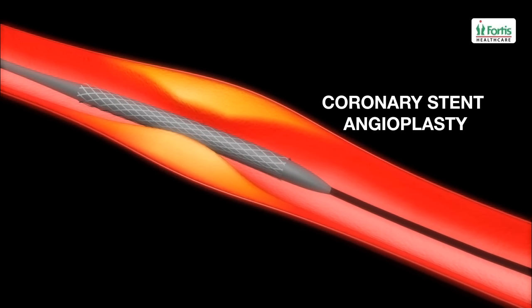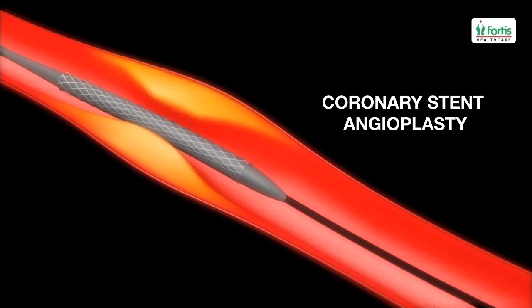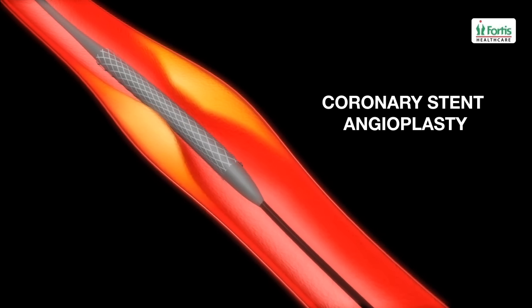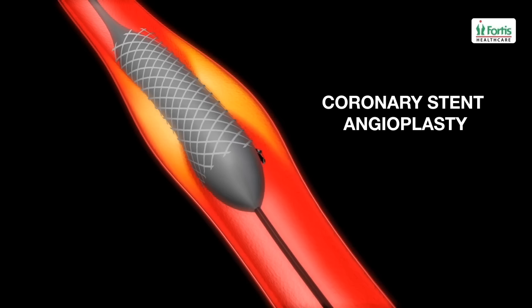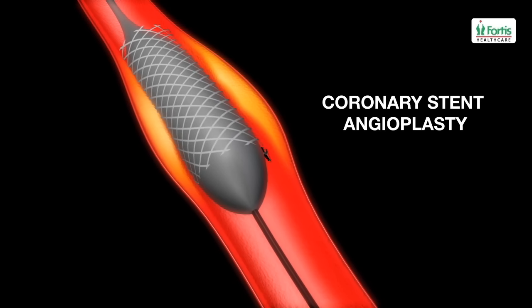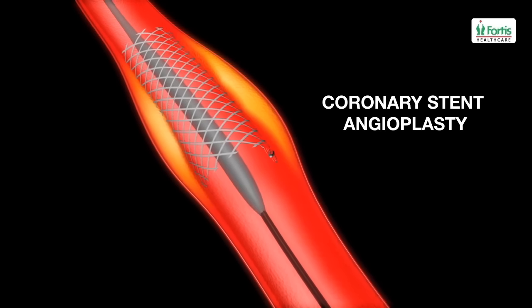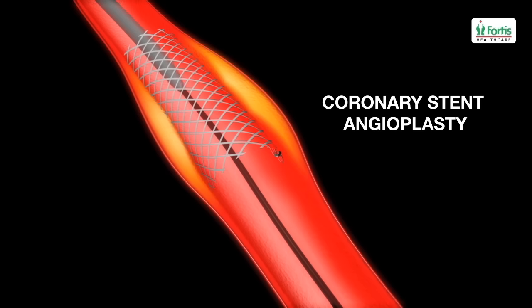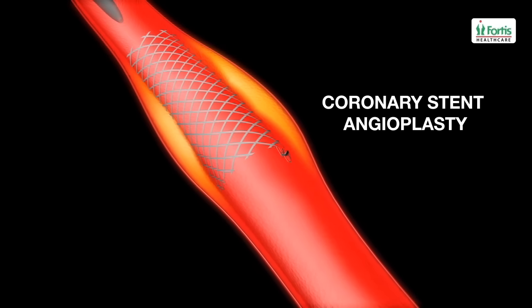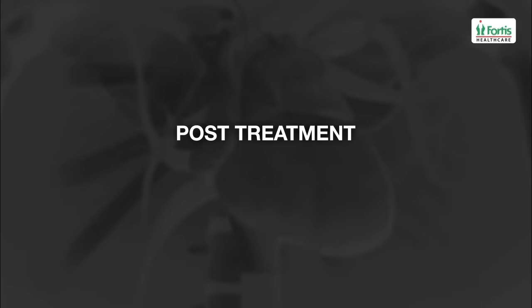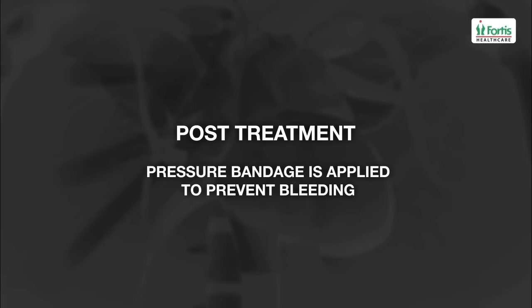A collapsed stent is placed over the deflated balloon catheter as it is inserted into position. When the balloon is inflated, the stent expands and locks itself into place. The deflated balloon and catheter are then withdrawn, leaving the stent behind to hold the artery open permanently.